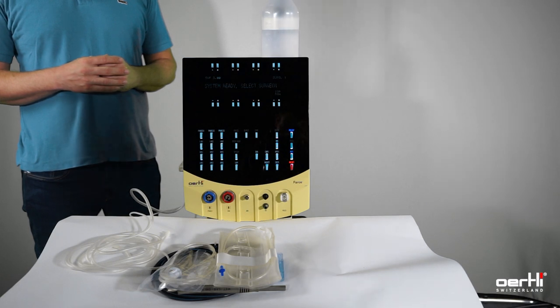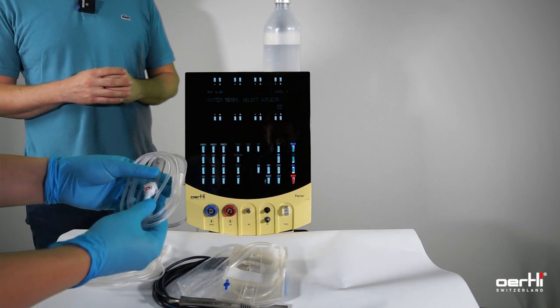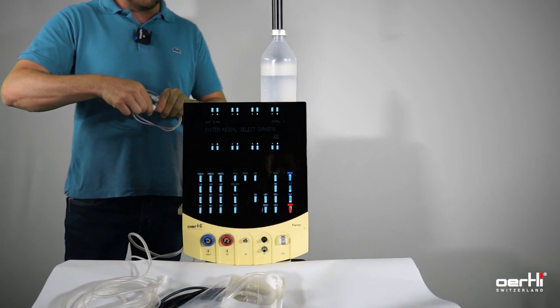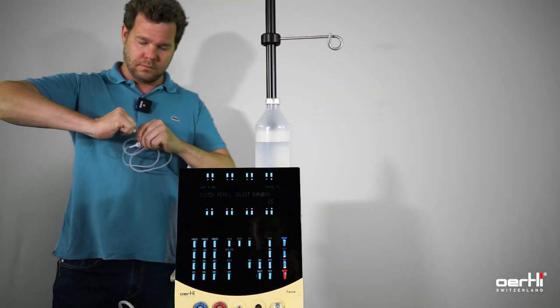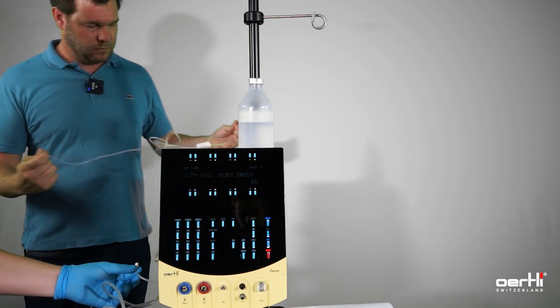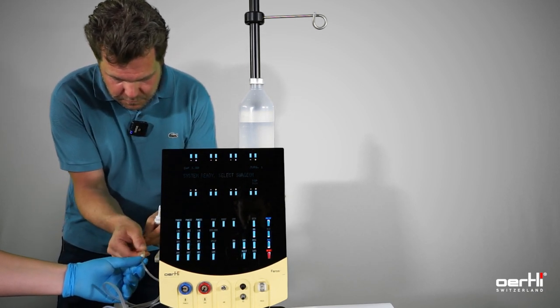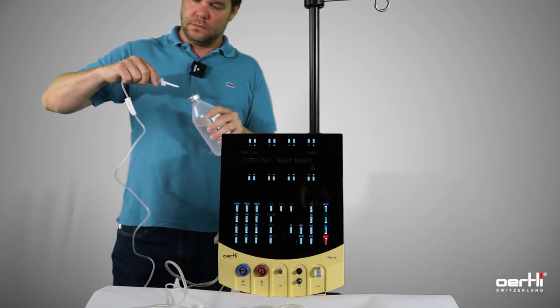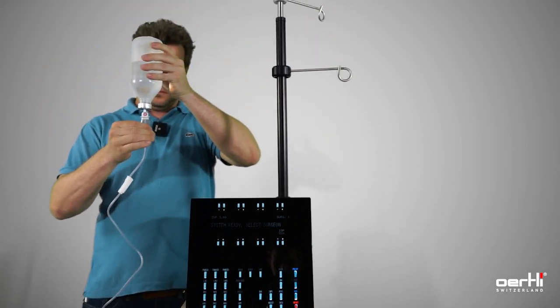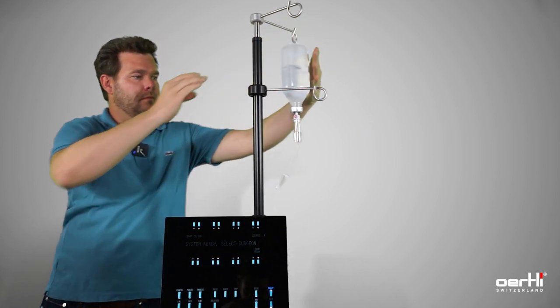Now you need some assistance from your jumper. Grab the infusion line and hand over the entire infusion line, letting the jumper do the installation. For the installation, connect the cassette system here on the short tube by removing the cover. Put the drop chamber to the BSS bottle and ensure that the valve is always showing downwards. Hang up the bottle and fill the drop chamber approximately 50%.